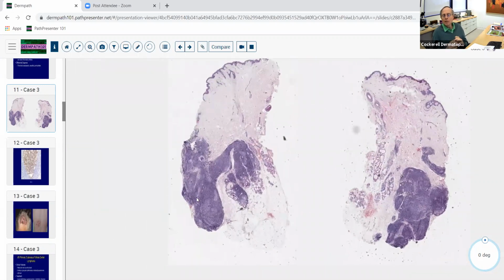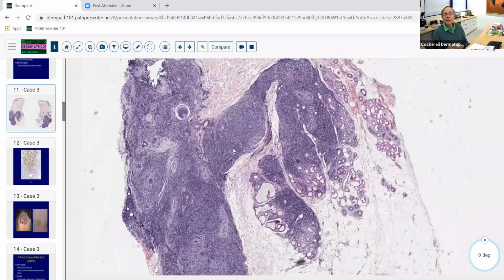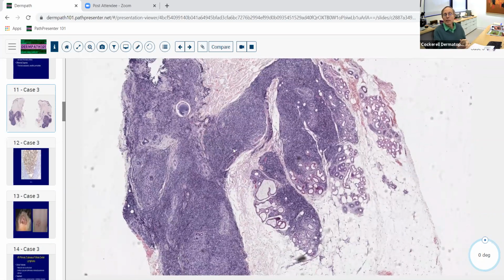that's comprised mostly of lymphocytes at low magnification, that's involving the bottom half of the specimen versus the top half of the specimen, so bottom heavy versus top heavy, we tend to think of that as being more characteristic of a cutaneous lymphoma as opposed to a pseudolymphoma or benign lymphoid process. Now that's not 100%, because you can actually see this specific type of lymphoma involving the upper part of the skin also. So it doesn't have to be down here, but when you see it here, you certainly should favor the possibility of it being a lymphoid process that's more likely going to be malignant.